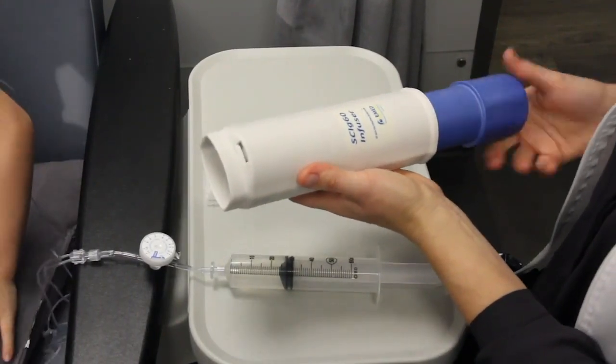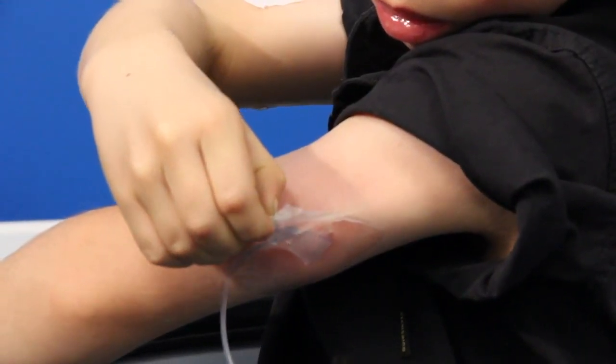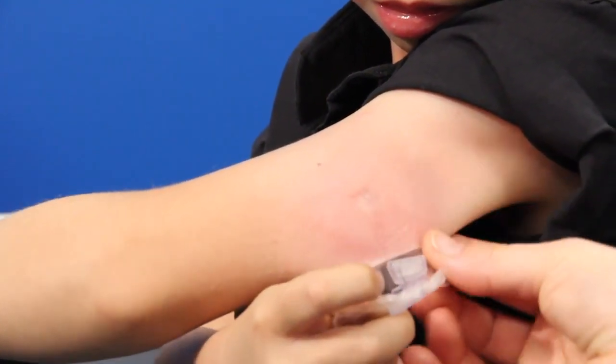Insert the syringe in the pump and screw the pump completely. Once the pump has finished the infusion, remove the transparent adhesive and the needles. Remove the apparatus from the pump and dispose in the biohazard container.